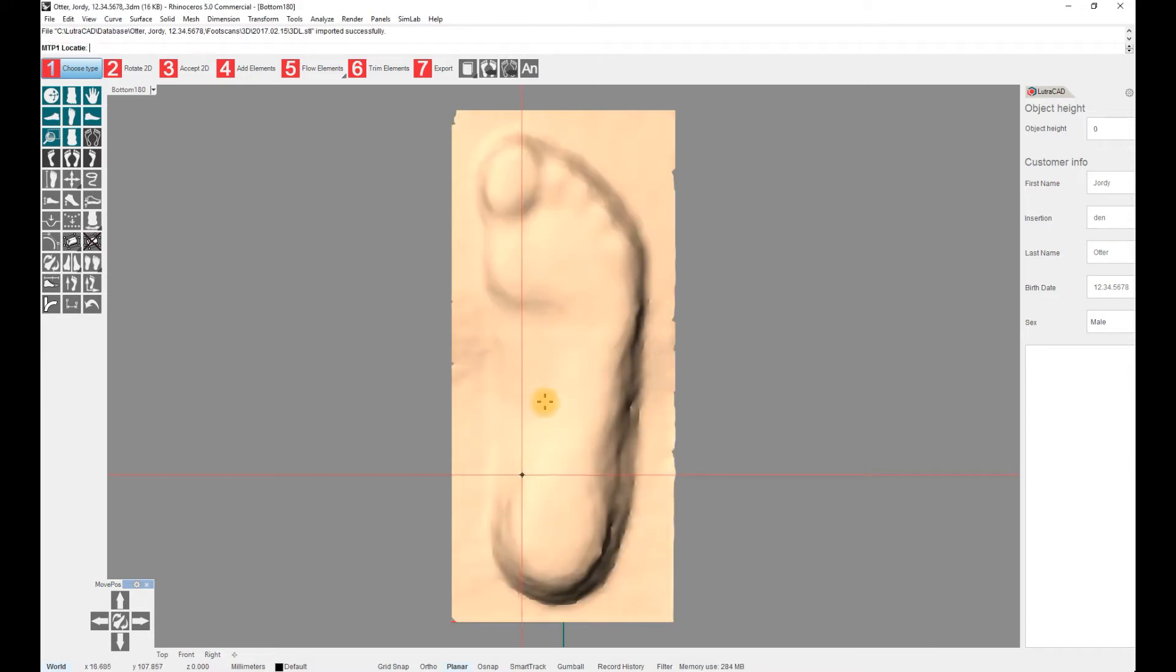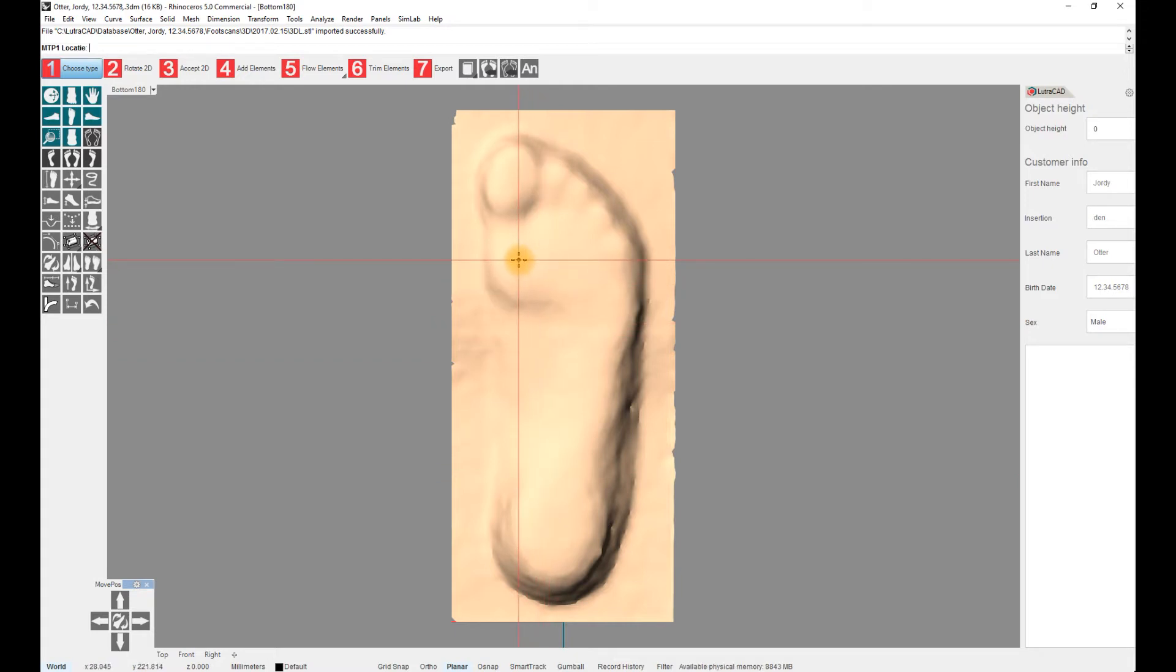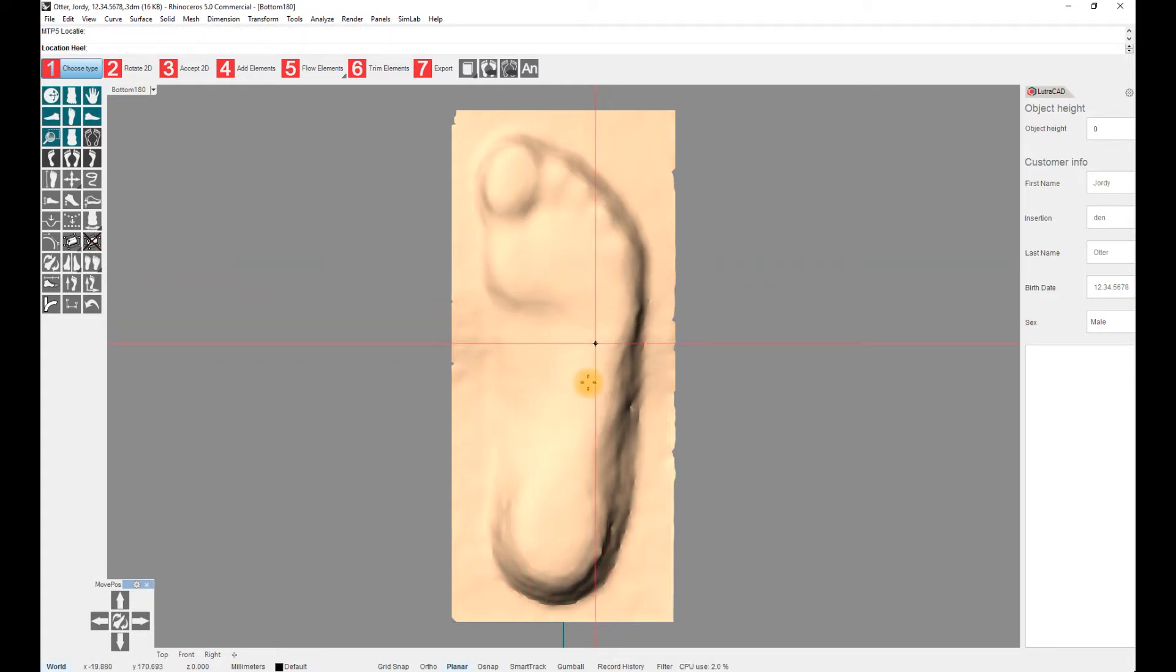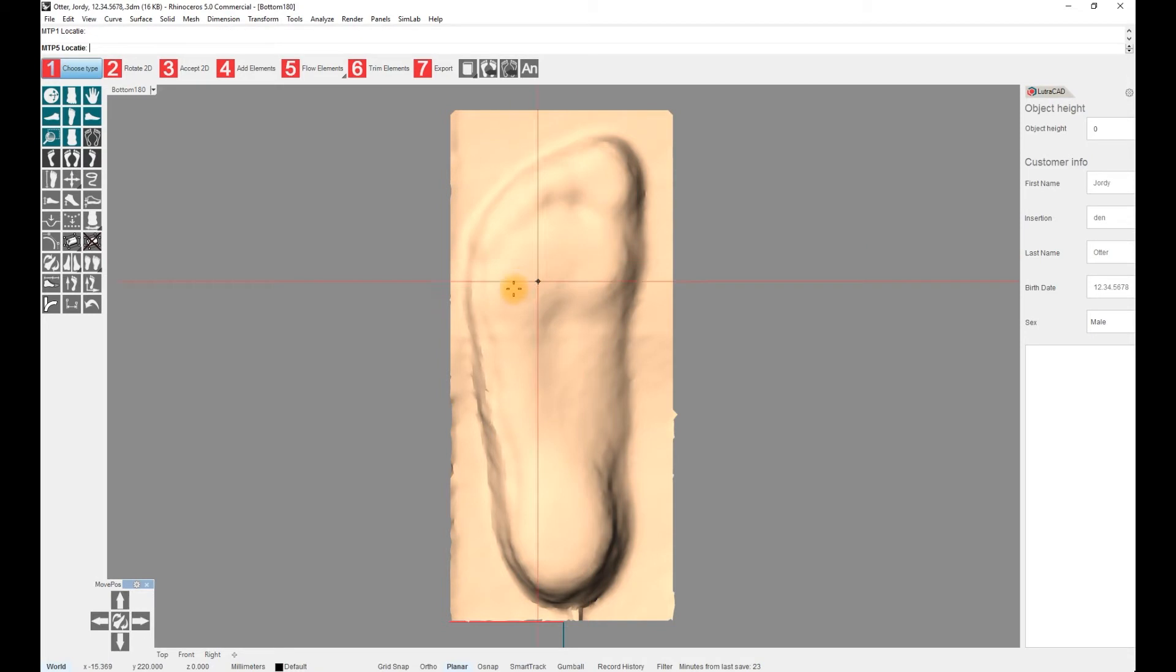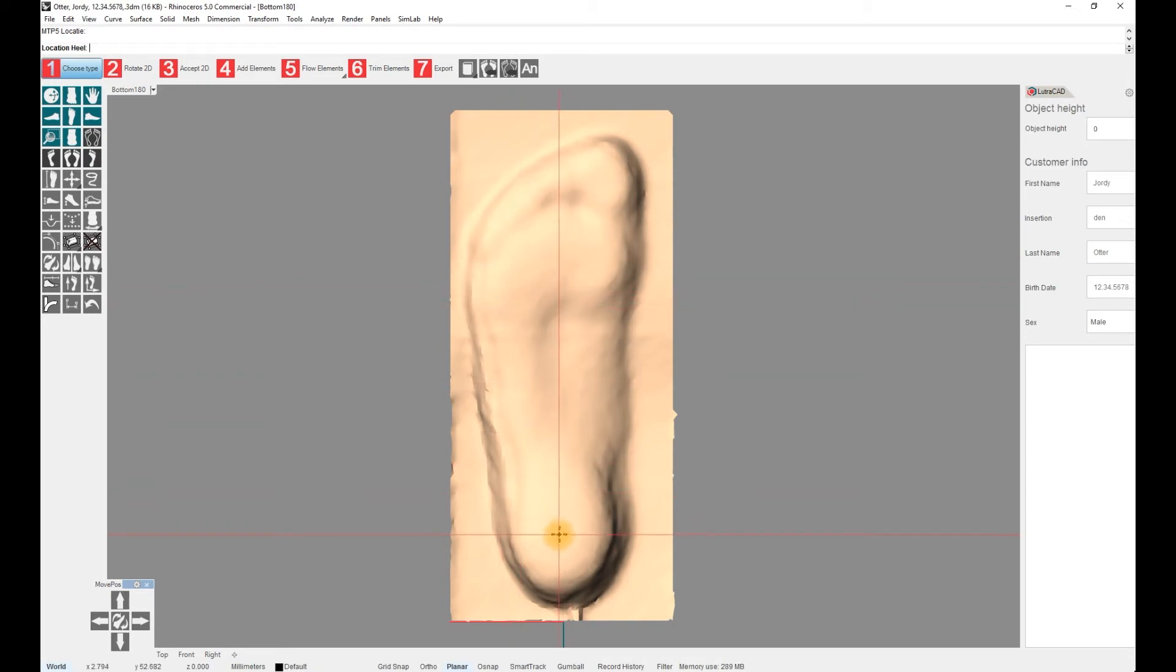To continue, 3 points need to be selected: Center of Metatarsal 1, Center of Metatarsal 5, and Center of the Heel. The software will automatically put these 3 points on the ground. These 3 points need to be selected for both feet.